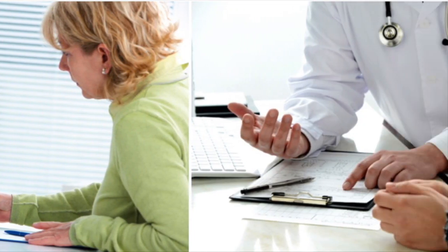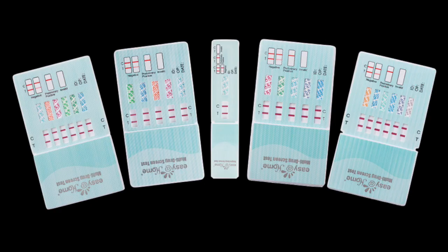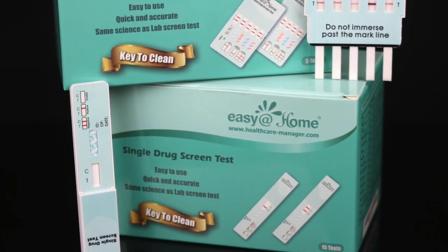Our customers include staff agencies, small businesses, families, physicians, rehab centers, and pain clinics. They always have plenty of combinations to choose from, coming in both multi-panel and single-panel dip cards depending on your needs.